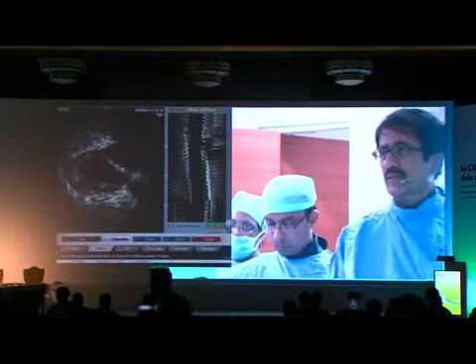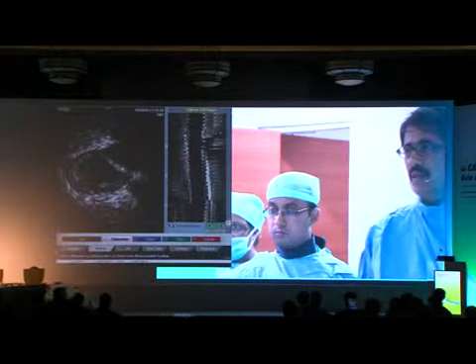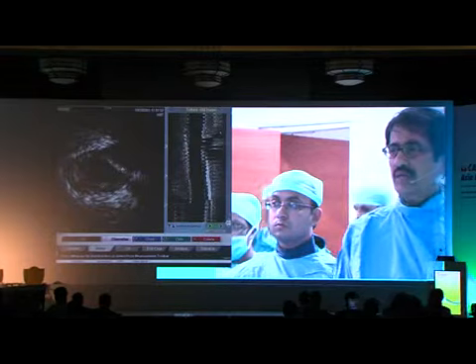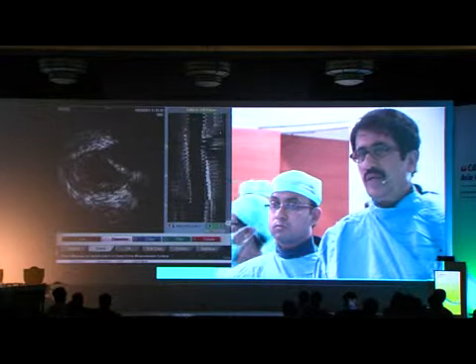Dr. Khalilullah? I think it's primarily a diagonal lesion, the ostium as well as further down. The LAD is not really significant. I totally agree with you, although there is some lesion, in the range of about 50% from proximal to distal part of the diagonal. Actually, we had the same feeling last year when we angioed him, and we thought the LAD is not important and to stay on medical treatment for the diagonal. However, it's pretty clear to me that if you're addressing this diagonal, the LAD has to be looked into.